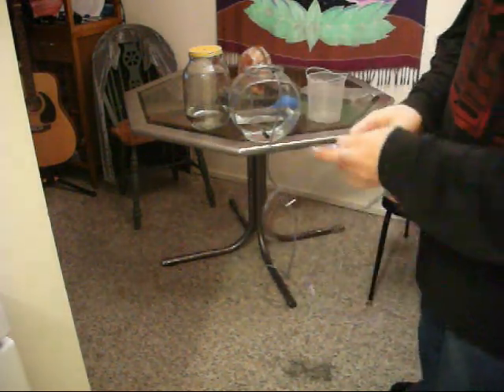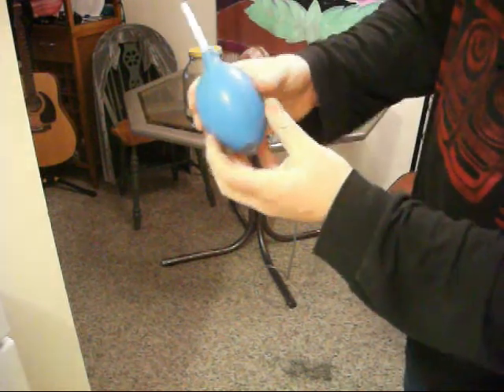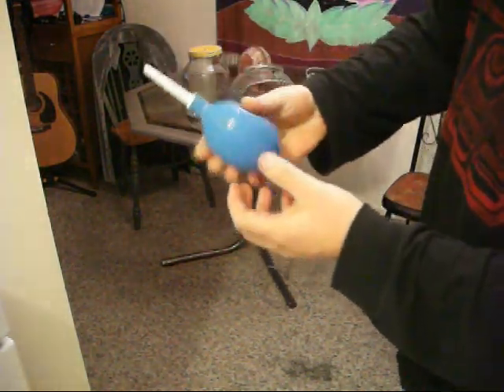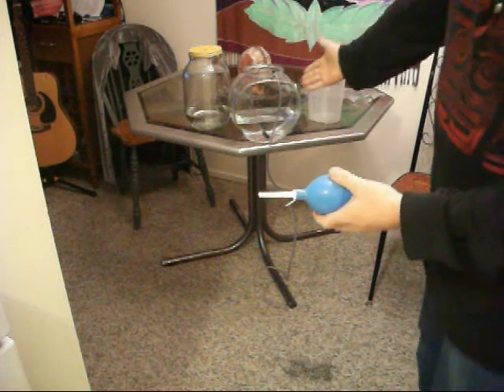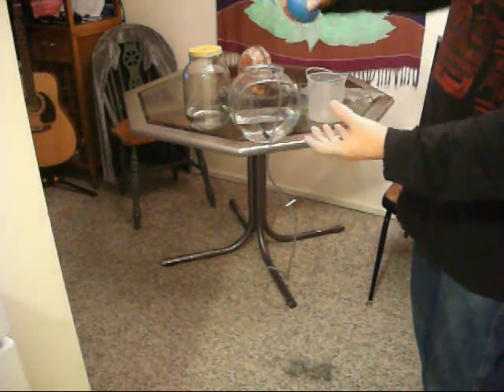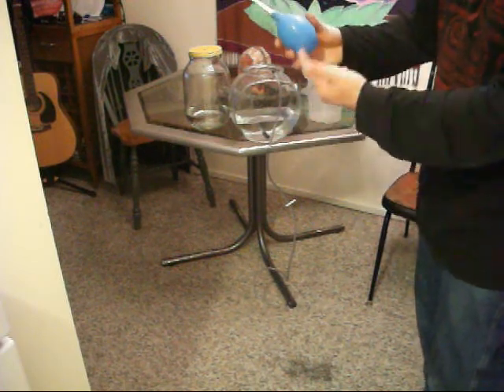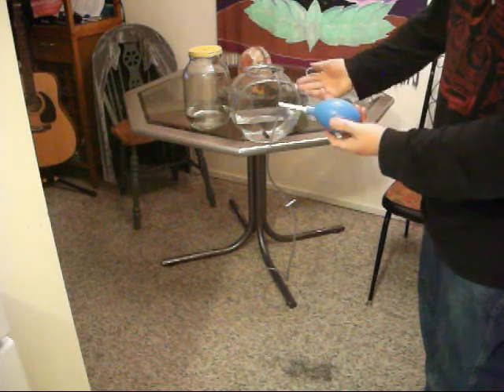I mean, if you really wanted, you could do this other version where you could buy your own tube, buy one of these enema bulbs, which I don't really like as much as something like this, because you have to insert this over and over and squeeze it and insert it and fill it up and squirt it. To get that much there would take like 20 or 30 of these possibly, or maybe even more.